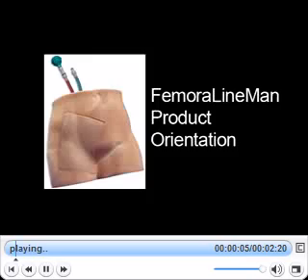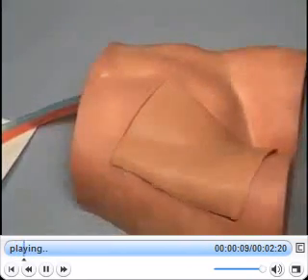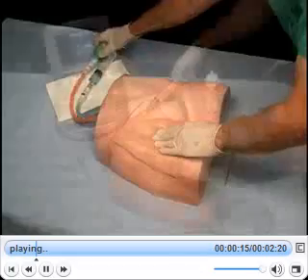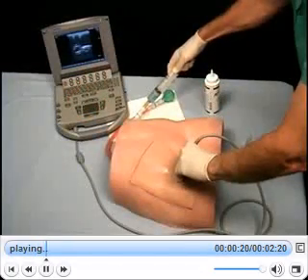The femoral lineman system offers many of the same key features as central lineman, including the palpable pulse, adjustable venous pressure, and two colors of simulated blood.